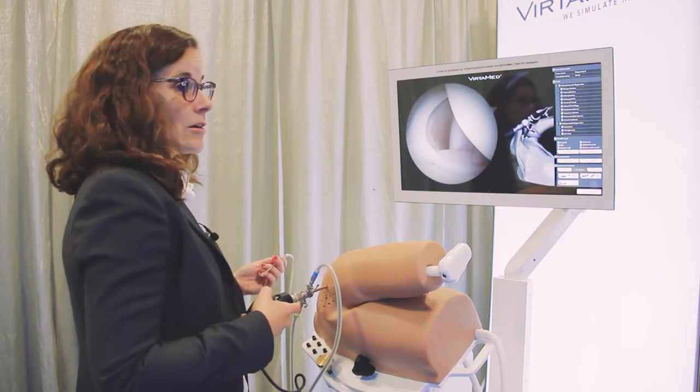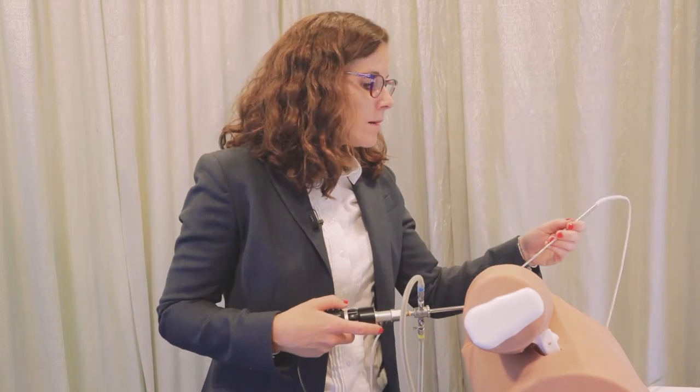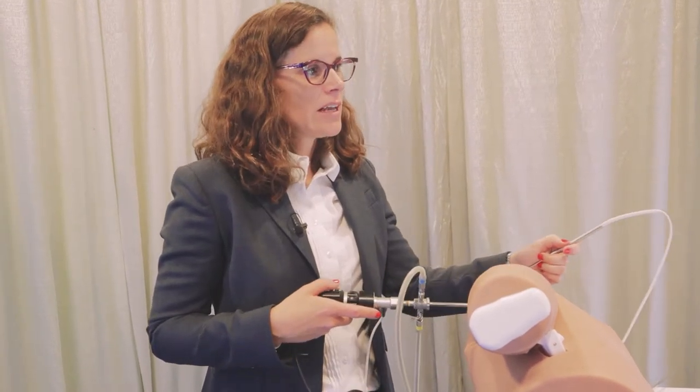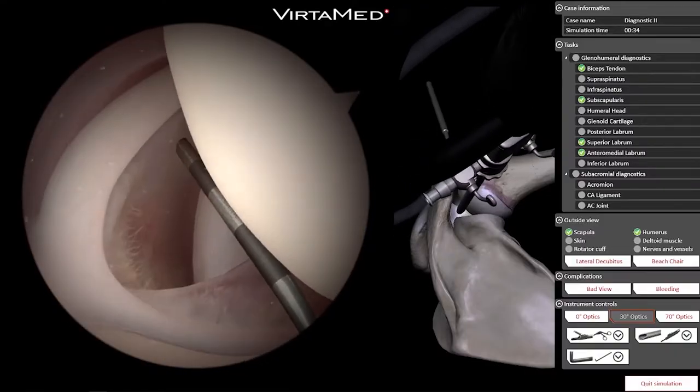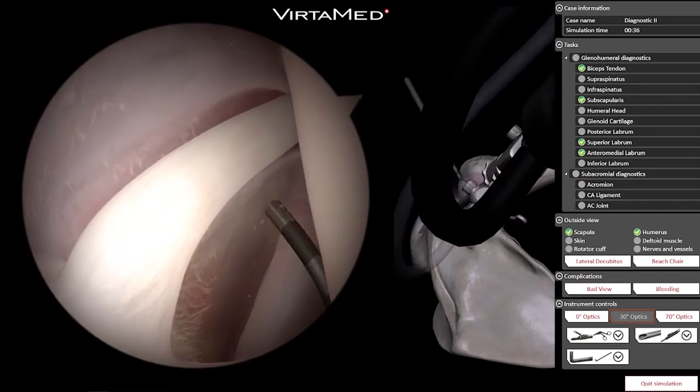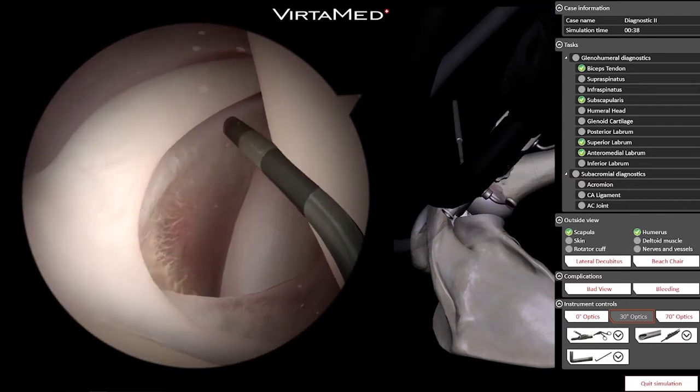This is one of the diagnostic cases in this module. The goal is to come into the glenohumeral joint and do the full diagnostic arthroscopy, looking for any related pathology. In real life, we would have examined the patient, have the history, and the associated imaging — so we go in already having a good idea of what we expect to find. I'm viewing from the posterior portal.